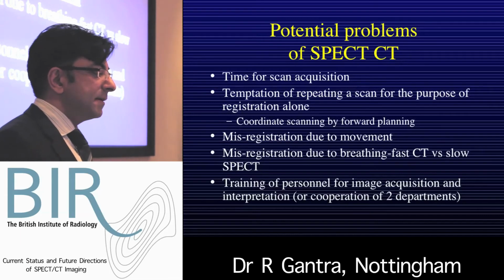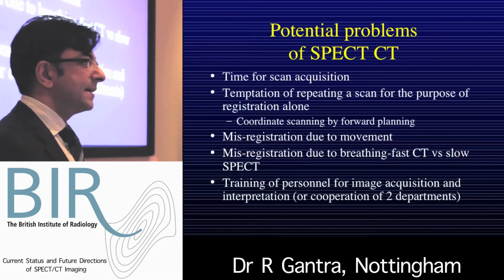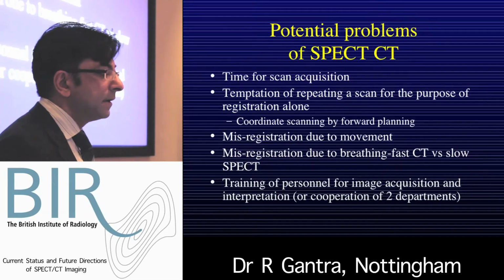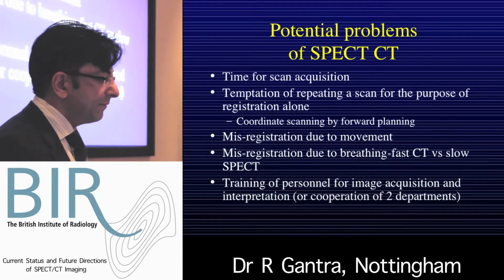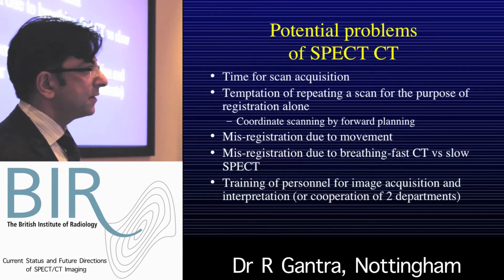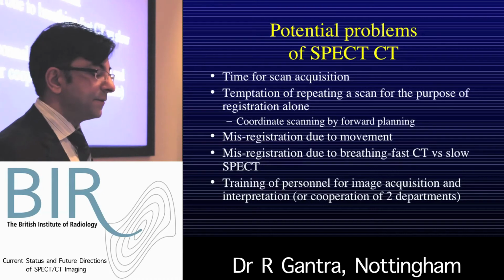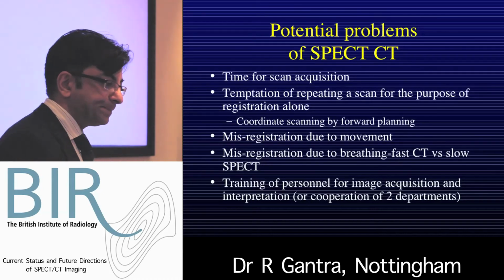But if a dedicated CT has been done 2 days ago, and it shows a lytic lesion in, I don't know, T5, and you've got increased activity at T5, there's little point in doing the co-registration just to prove that fact. There are misregistration issues due to movement, due to respiratory motion, and there are training issues, and we'll hear at the end of the day about some of the training that's available and how to get around the training for really 2 different modalities coming together.